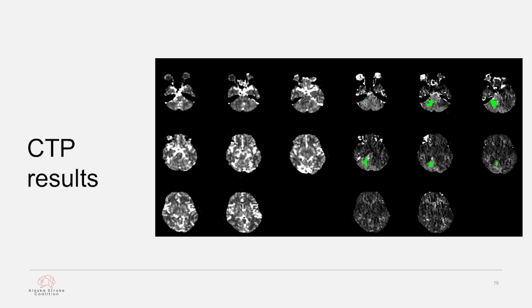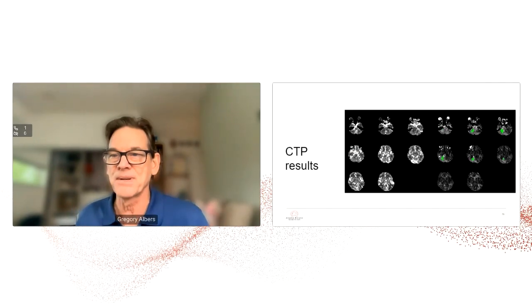I think the point was excellent about the gait abnormalities. If there's a bad headache, that is also something that's less typical in benign vertigo and more common when you're having a stroke. So there are some clinical hints, but sometimes it's just impossible to tell without the imaging. So CT perfusion can be a good screen as long as your protocol is capturing the cerebellum. Some CT perfusions, we see that the cerebellum gets missed.